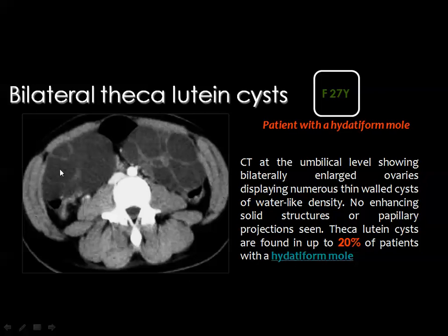You see both ovaries are markedly enlarged. They contain a lot of cysts of large size, and you see some ovarian tissue in between.